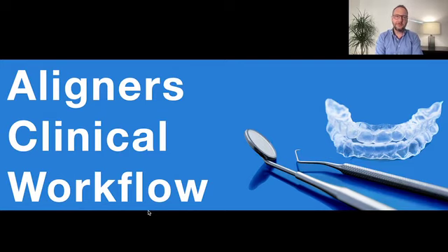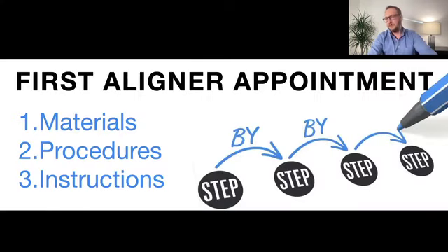Maybe as important as the whole treatment, because a lot of times the orthodontist or the doctor doing the treatment can ruin the whole treatment by using the wrong kind of burr to remove attachments and destroy the enamel. This is a very serious topic. But first things first. For my first aligner appointment, I like to start easy with my patient. I never like to bond the attachments in the first appointment.